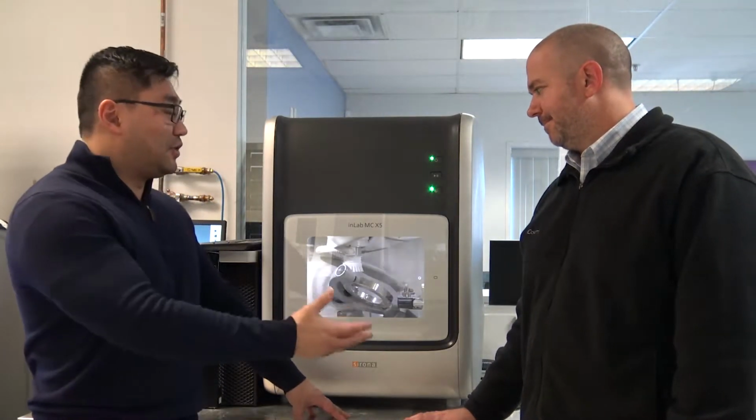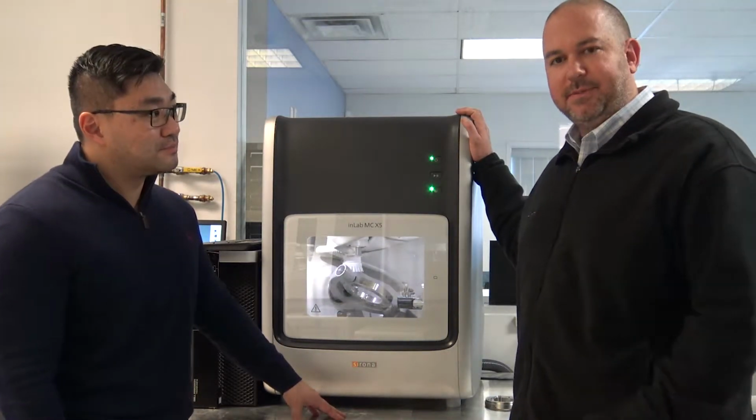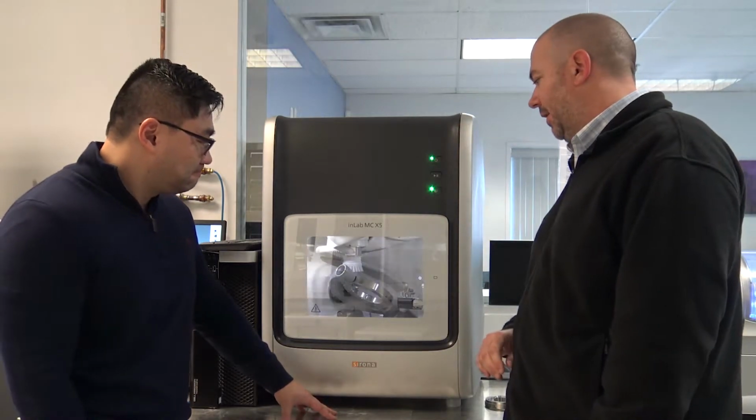Okay, so we are here with the MCX5 mill. Jay, if you could please just give us a quick rundown of this mill. Sure thing. This is the inLab MCX5. It is a wet-dry mill. It's 5-axis and has open STL.